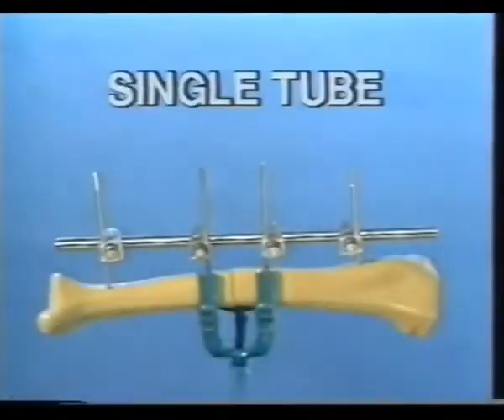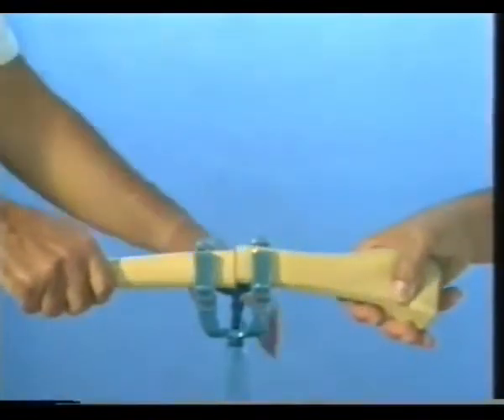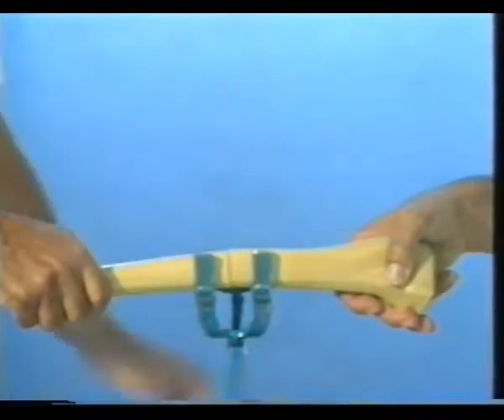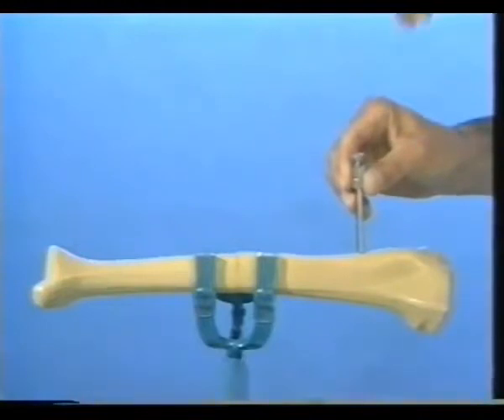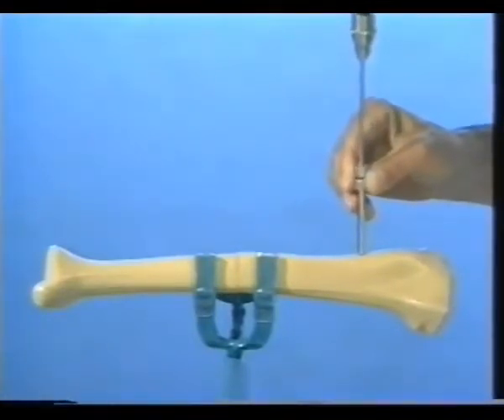The first exercise is the construction of a single tube unilateral fixator. The fracture is reduced and the bone mounted in the vice grip. The short drill sleeves with Trokar are inserted through a small stab incision about two centimeters distally from the tibial tuberosity. Remove the Trokar. Using the air drill and a long 3.5 millimeter bit, drill through both cortices.